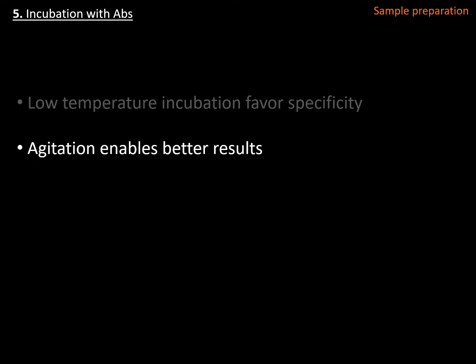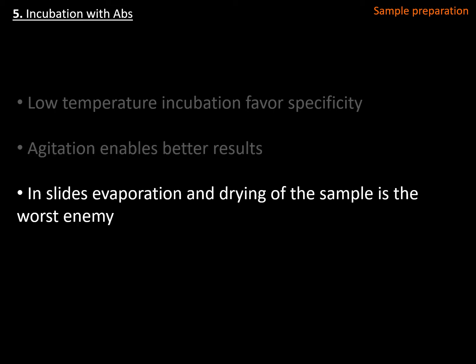Of course, agitation enables better results because it enables a better homogenization of the solutions and of your antibodies into the tissue. And you should always bear in mind that if you are doing immunohistochemistry in slides, evaporation and drying of the samples is your worst enemy, and you should always take care to avoid this type of issue, for instance by using wet chambers during the incubation time.